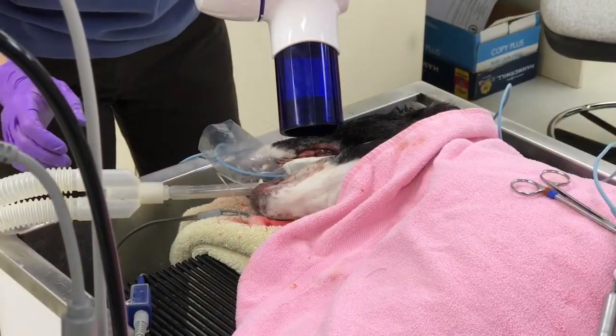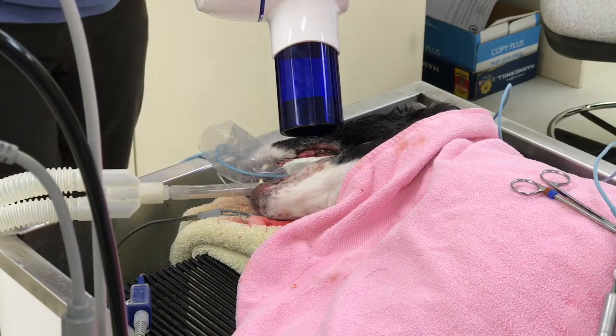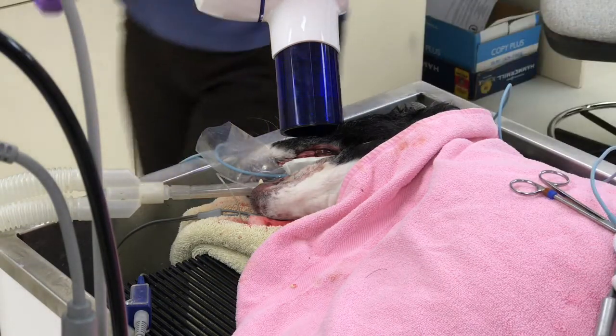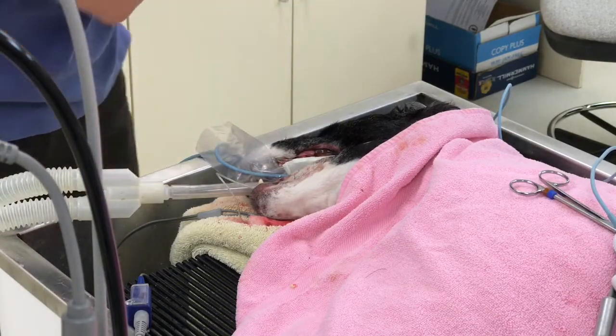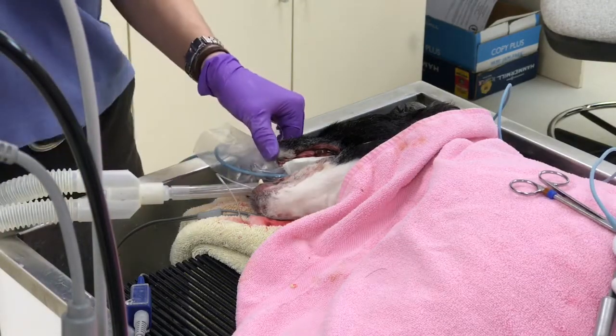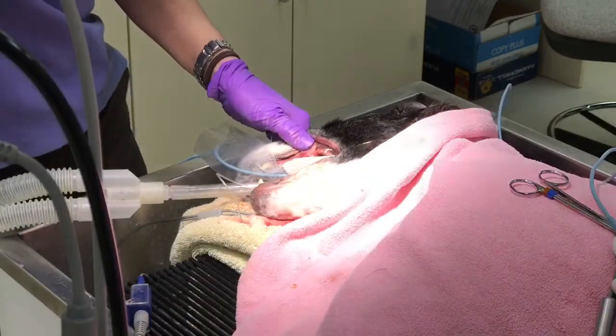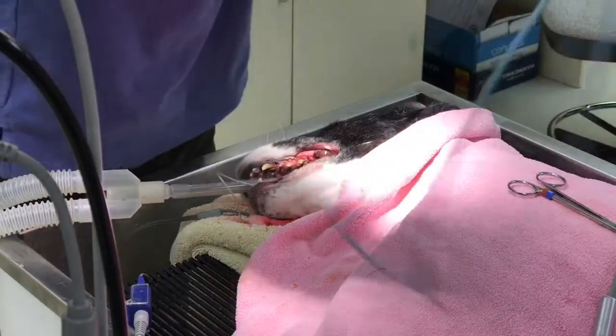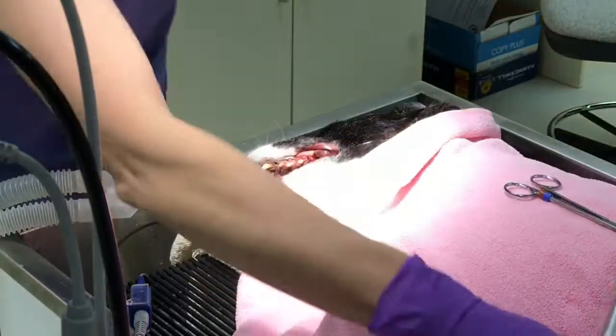Alright. So now we're performing an x-ray to confirm that we have removed everything. And confirmation is that we do have all of our roots out. So we will proceed with cleaning the rest of this dog's teeth, and we are completed with the actual extraction.